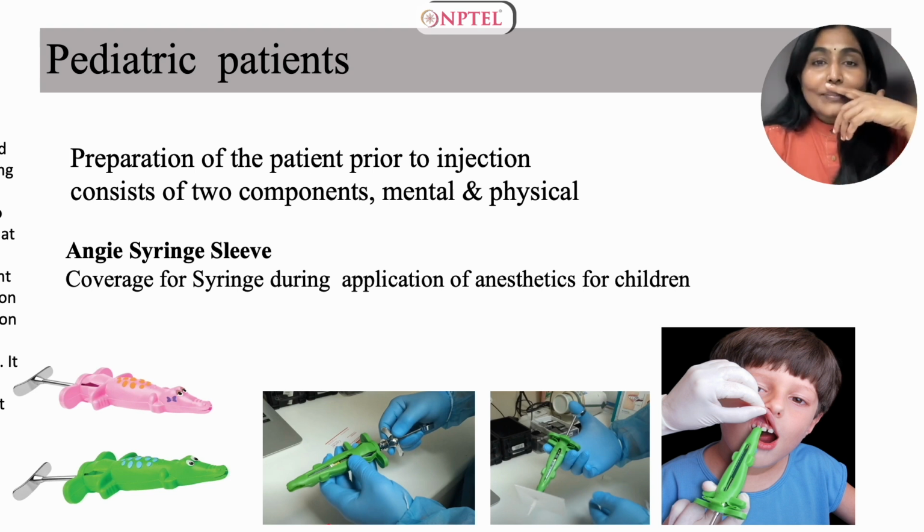But it is also desirable to distract the patient when receiving the anesthetic syringe from the dental assistant. Or you could also consider using a syringe with an attractive syringe sleeve, like what is shown here, the Angie syringe sleeve. These are definitely less menacing and more receptive to pediatric patients.